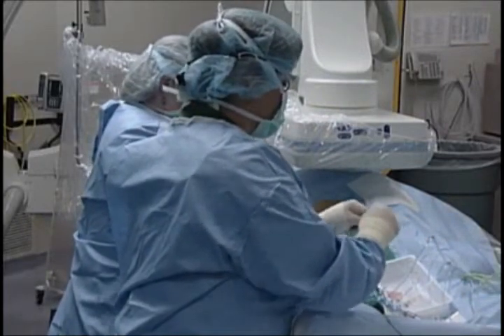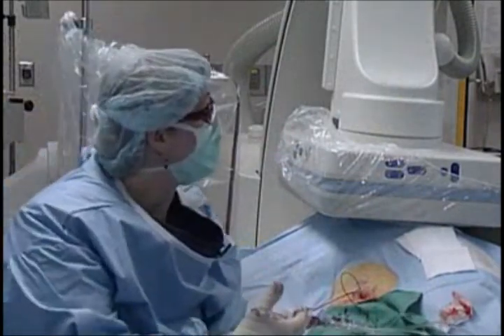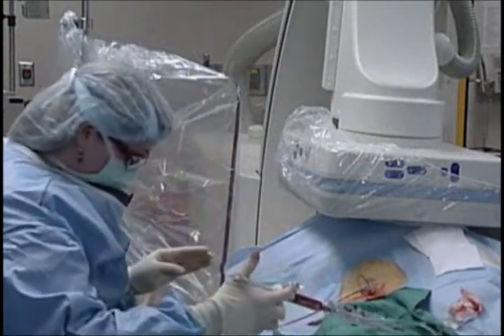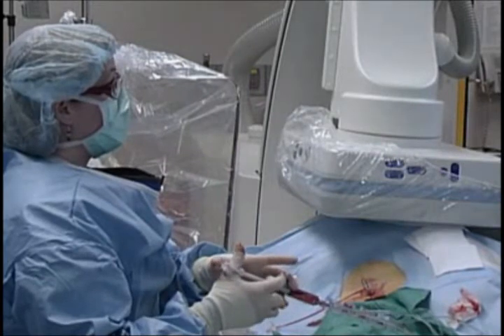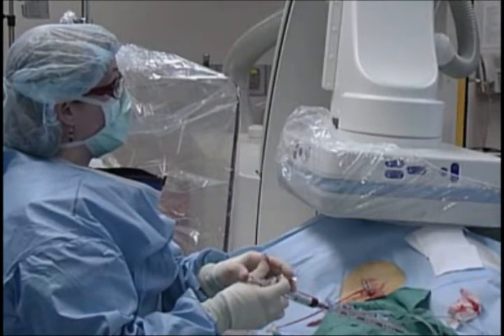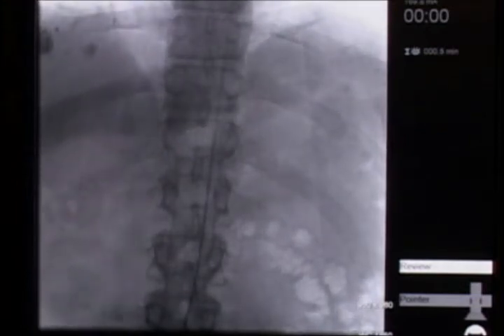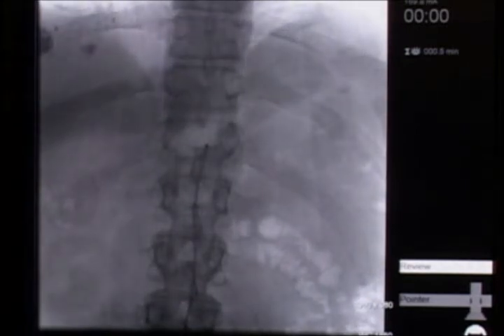What we'll be doing next is placing a catheter that will be selectively positioned in the celiac axis origin, which is the blood vessel that supplies branches to the spleen, the stomach, the liver, as well as small bowel. That imaging is important to lay out the anatomy and a roadmap, so that we know where we need to be going. This particular patient does have some normal variant anatomy, which is fairly common — about 25% of patients will have some type of normal variant anatomy in terms of their arterial supply to the liver.